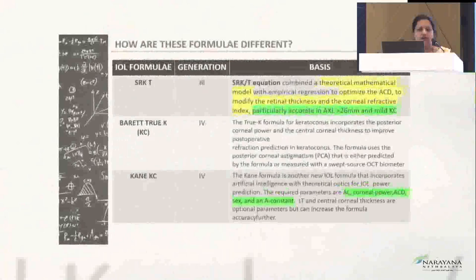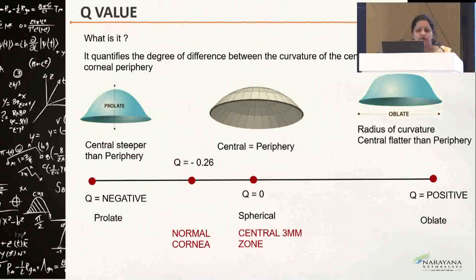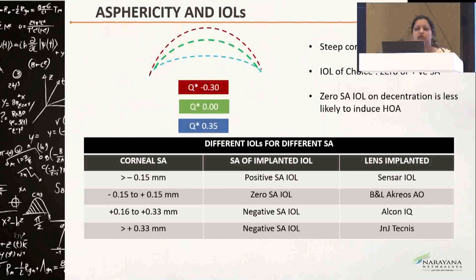Coming to which IOL would you choose? We all know that the central cornea is steeper than the peripheral cornea, which gives us a prolate cornea, which has a Q value which is negative. In keratoconus, this Q value is altered and becomes more negative. So we need an IOL which has at least zero or a positive spherical aberration.